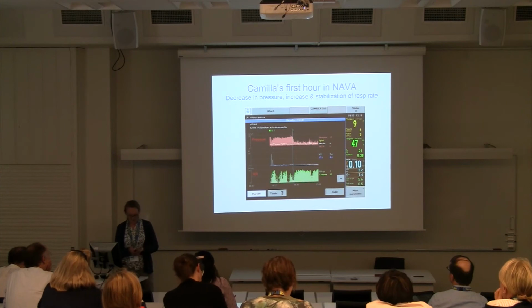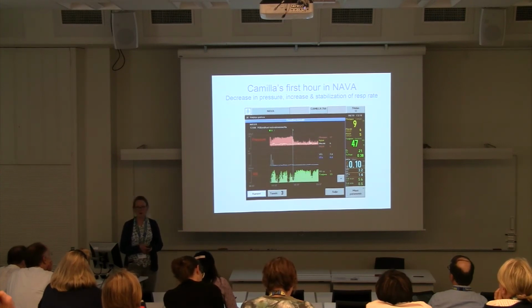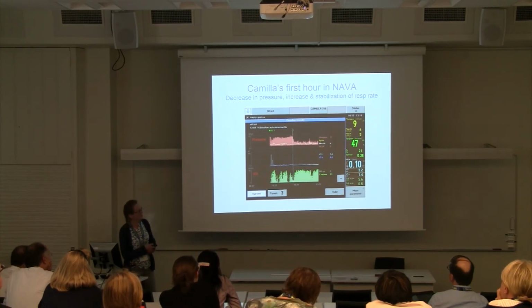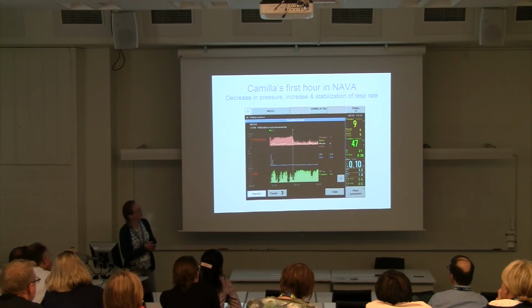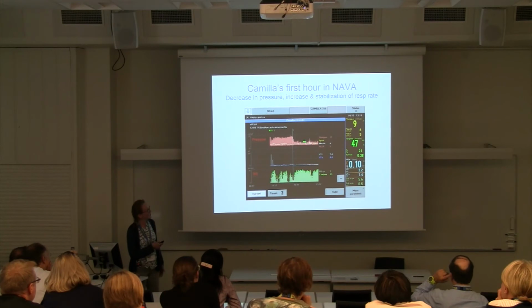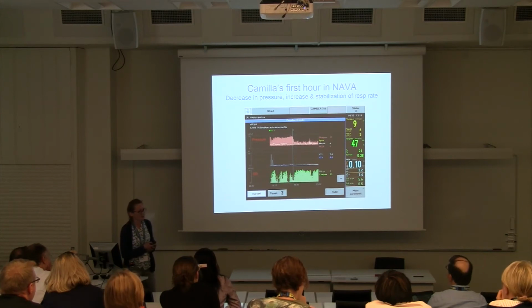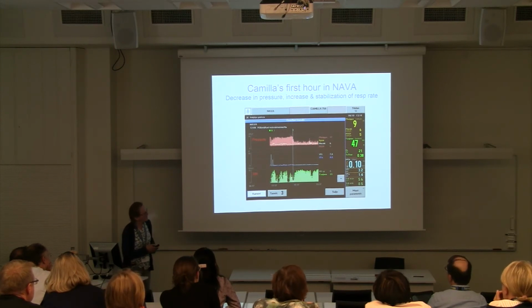And here you can see Camilla's first hour after she was switched to NAVA ventilation. So the screen is for 3 hours. And she had the EDI catheter 1 hour when she was still on SIMV plus PS support. And this is her NAVA. And here you can see the pressure curve and the significant decrease in pressure immediately after the baby is switched to NAVA. Here you can see her respiratory rate, and after the switch to NAVA, her own respiration becomes more regular.